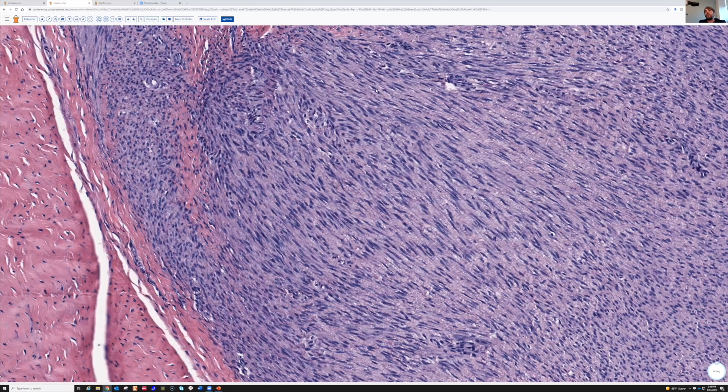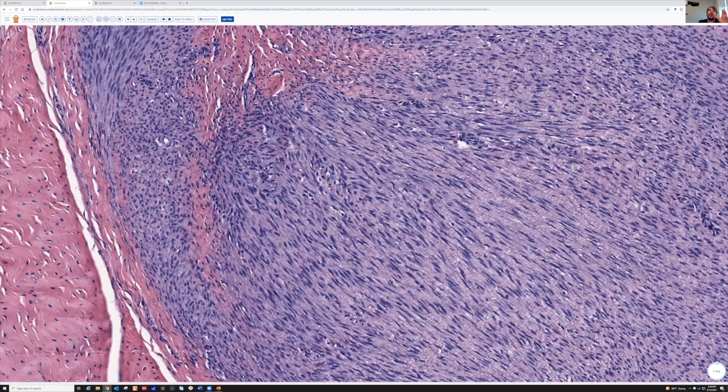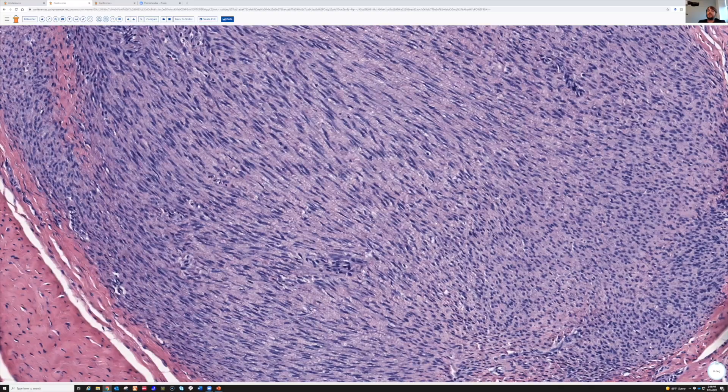Look at how they run in the biggest fascicle you can imagine — all running the same direction in parallel. It'd be like a highway a hundred lanes wide, the biggest widest road in the world. So that very broad sweeping fascicles of bland spindle cells.